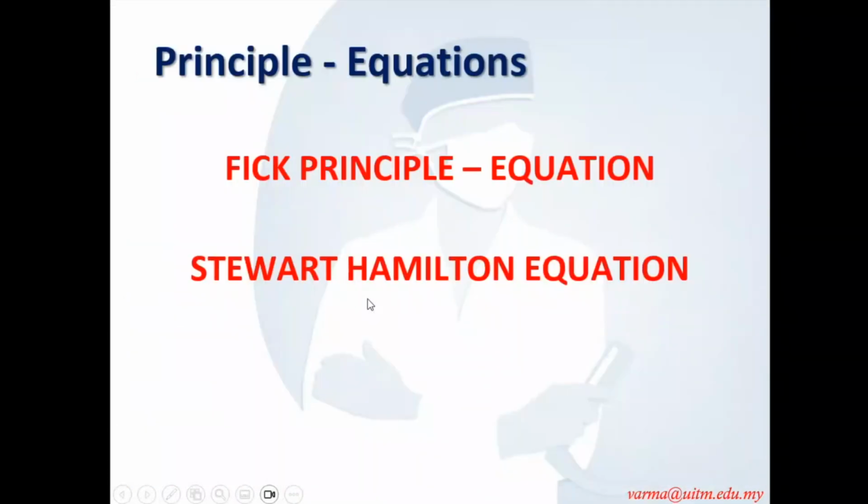Now we go to the principles. What is the principle behind advanced hemodynamic monitoring? First, you have two equations, Fick's principle equation and the Stewart-Hamilton equation. This will be asked in your level. We have talked about this during our oxygen delivery classes previously. Those who haven't watched it, please go and watch the recording about oxygen delivery: how do I calculate the VO2 and DO2, oxygen flux and everything.